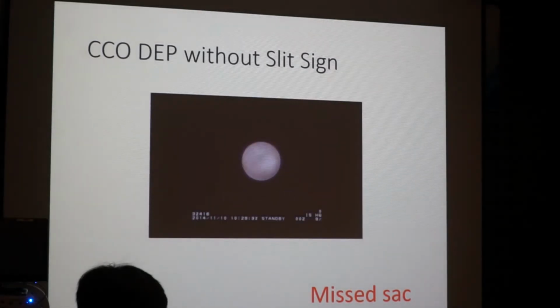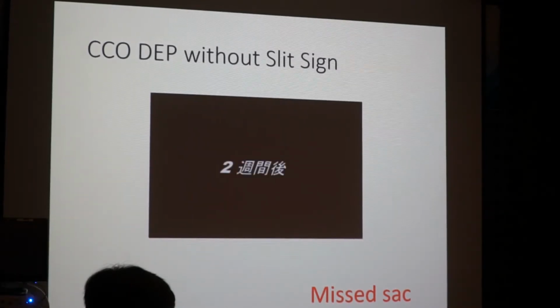I'm in the right side common canaliculus, and what I'm doing is depth. After breaking the membrane, I cannot see the patent lumen, and what I can see is just whitish space surrounded by fibrous tissue. There is no slit sign. At this time, I don't have a good feeling, so I discontinue.